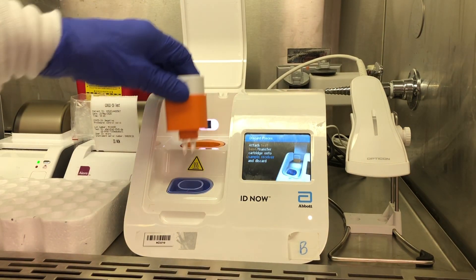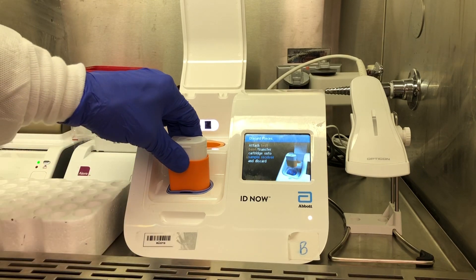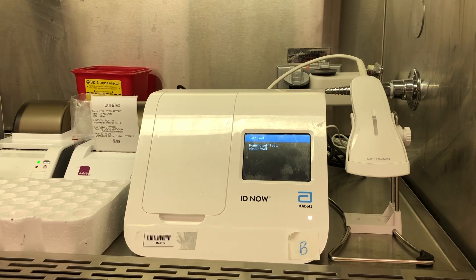From here, you can remove everything. The test base clicks into the sample receiver, which is why I'm rocking it back and forth to make sure it's clicked in, and then I dispose of it. After you close the lid, it's going to perform a self-test, and that is how you perform the COVID-19 test on ID Now.